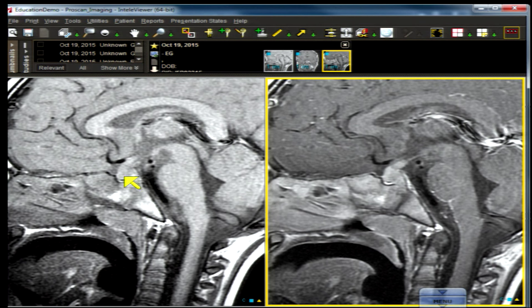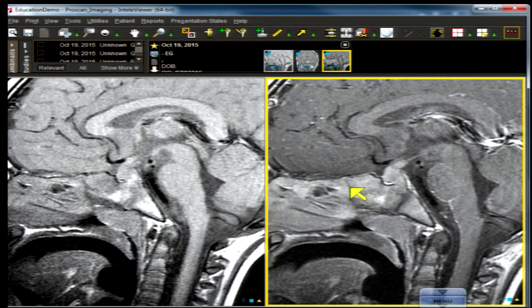This three-year-old child presents with diabetes insipidus. Let's have a look at the imaging — a sagittal non-contrast T1 and a sagittal contrast-enhanced T1-weighted image. Have a gaze for a moment; I'm going to move on to the questions.